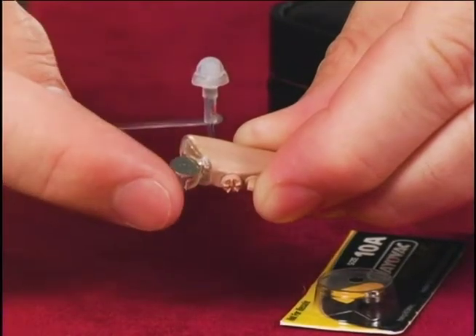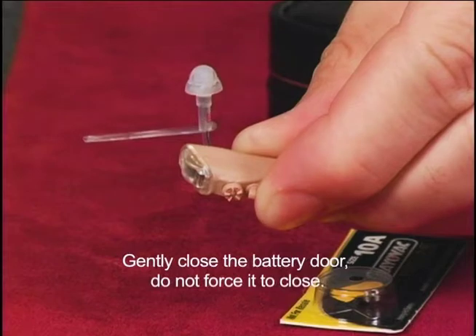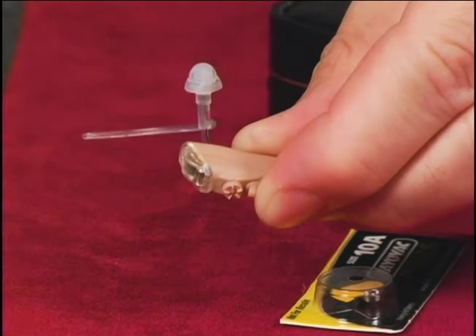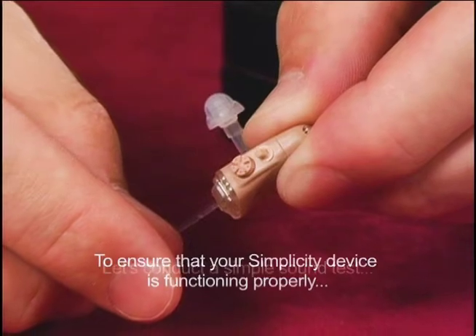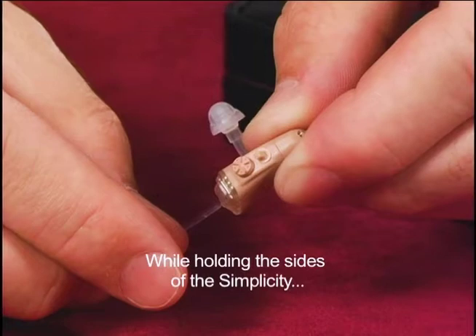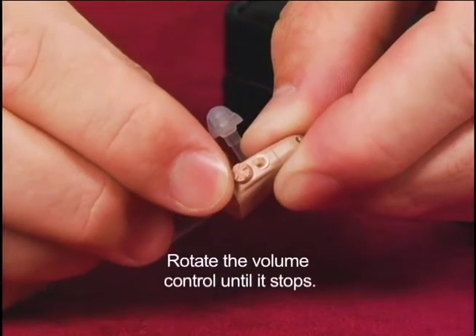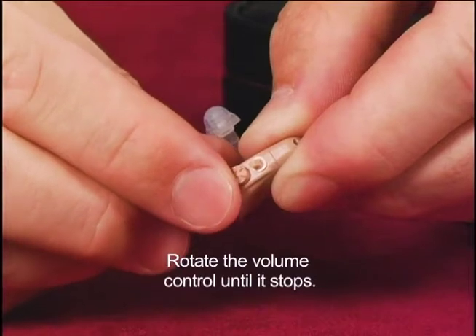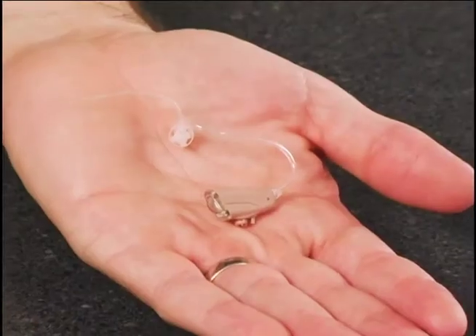Once the battery is installed, gently close the battery door. If the battery is installed incorrectly, the battery door will not close. To ensure your Simplicity is functioning properly, let's conduct a simple sound test. While holding the sides of the Simplicity between your thumb and forefingers, rotate the volume control clockwise until it stops. The volume is now full on.